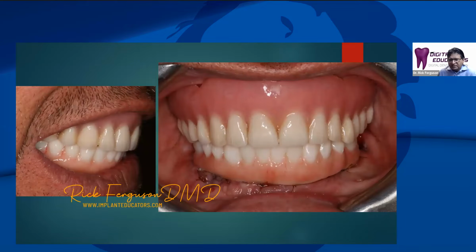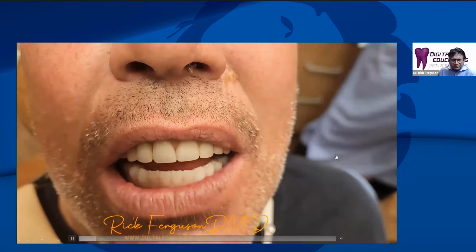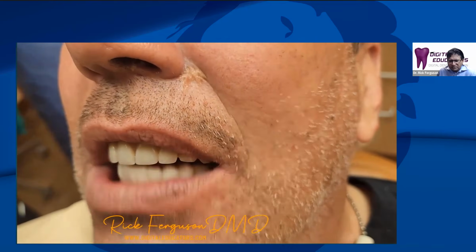This is immediately after we placed it after the surgery. That afternoon, the patient was able to go home with a fixed prosthesis on the lower. So that's where he started. Of course, he still had his upper denture. We're going to do the upper at the next surgery. And here is him. Here is the bite that we're able to get using this technique, right? And the patient was able to go home with this prosthesis.